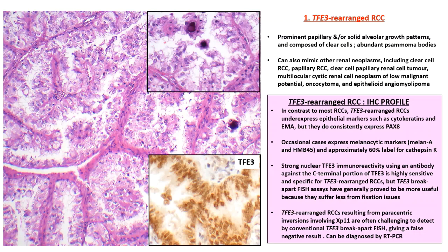And because there is an issue of fixation heterogeneity and not all tumors will be equally fixed, IHC might not always give good results. So in this particular case, FISH, that is the break-apart FISH for the TFE3 gene, is actually a better diagnostic procedure to choose compared to TFE3 immunohistochemistry.